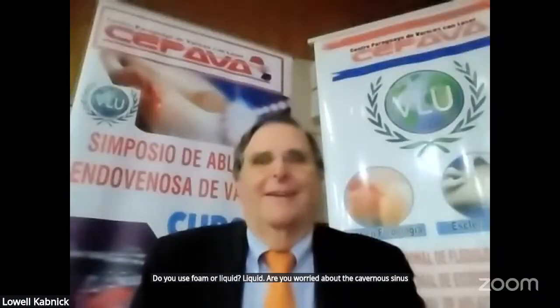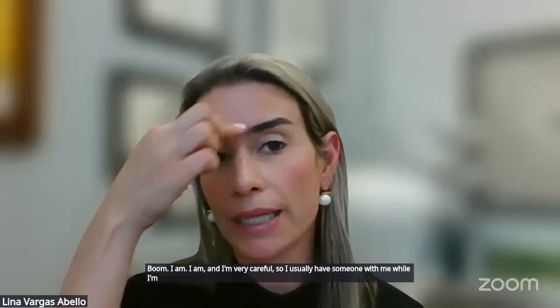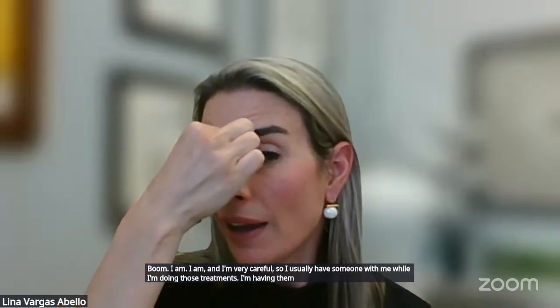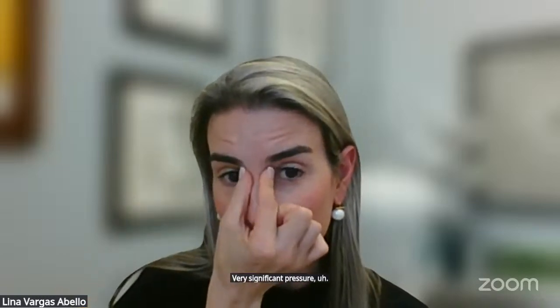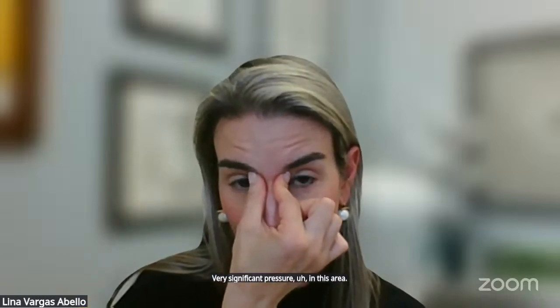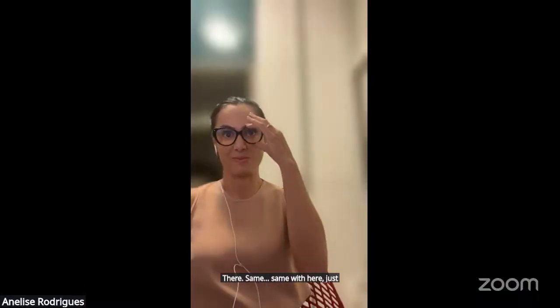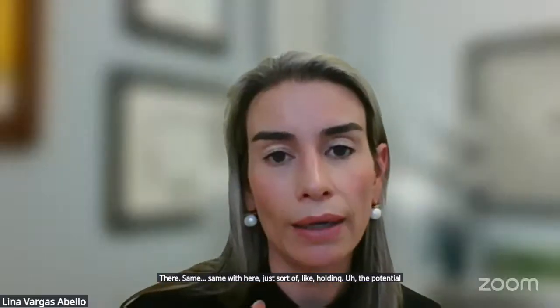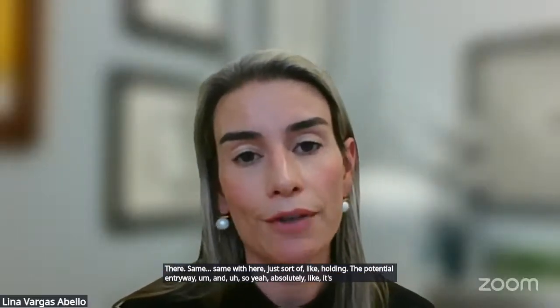Are you worried about the cavernous sinus? I am, and I'm very careful. So I usually have someone with me while I'm doing those treatments. I'm having them apply very significant pressure in this area to block there. Same with here, just holding the potential entryway. So absolutely, it's something you have to be worried about.